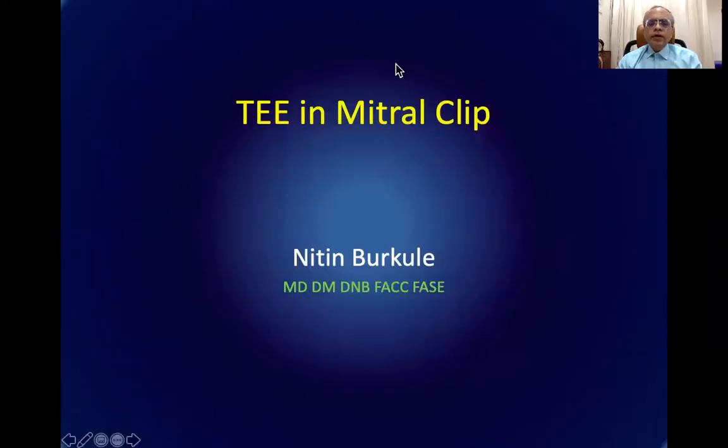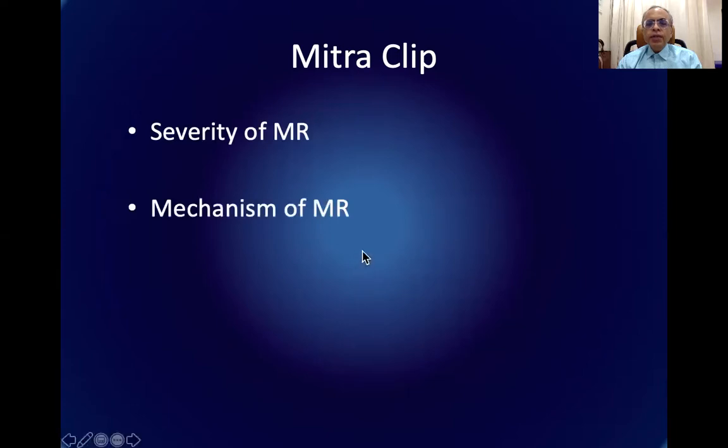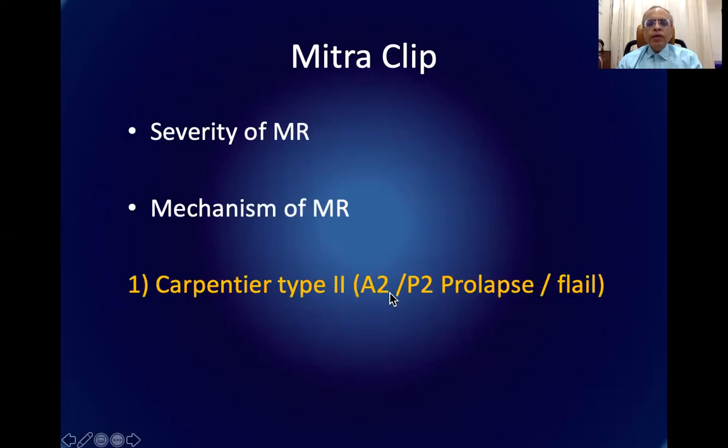Dear friends, transesophageal echocardiography has a central role to play in MitraClip procedures. Before the MitraClip, one should be very sure about the severity of mitral regurgitation and the mechanism of mitral regurgitation. The MitraClip can address either the Carpentier type 2 or the secondary mitral regurgitations.